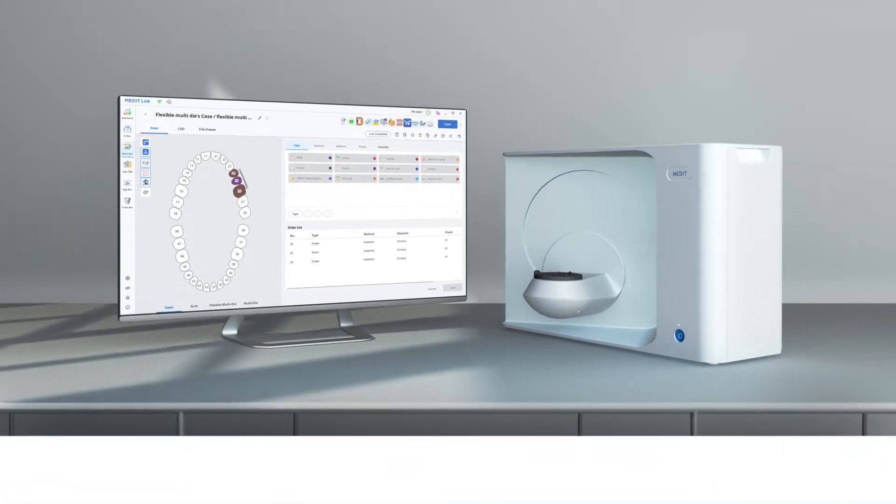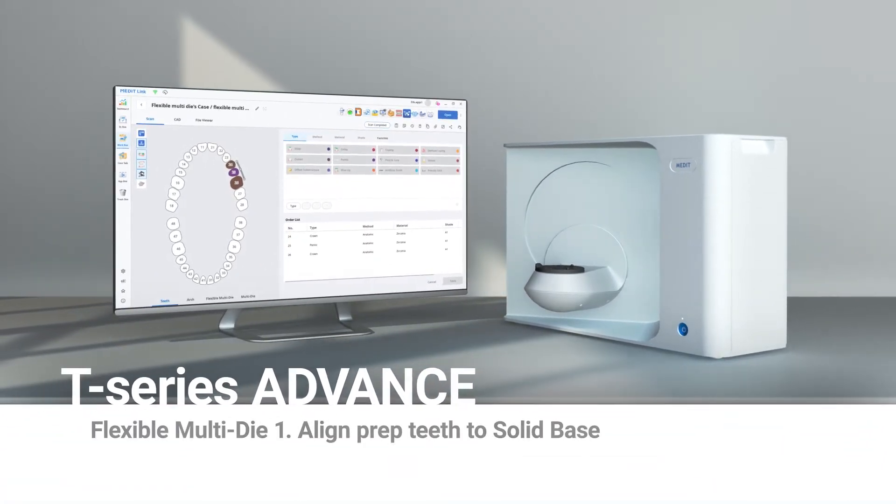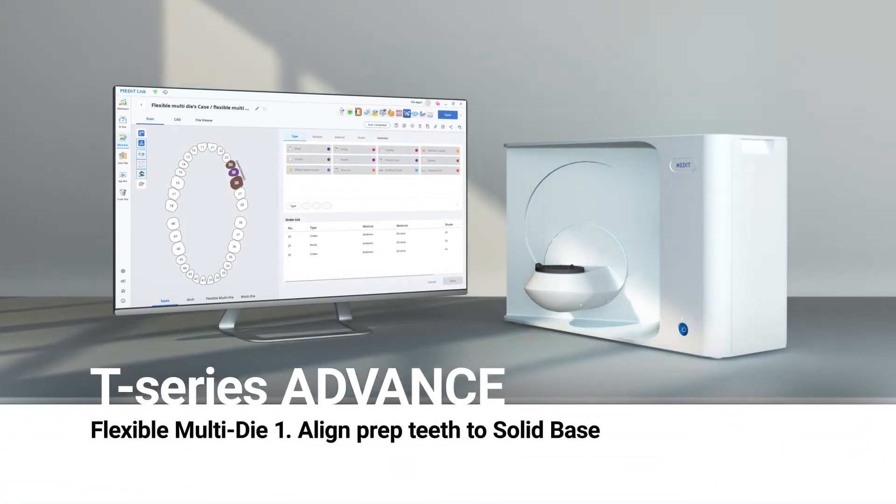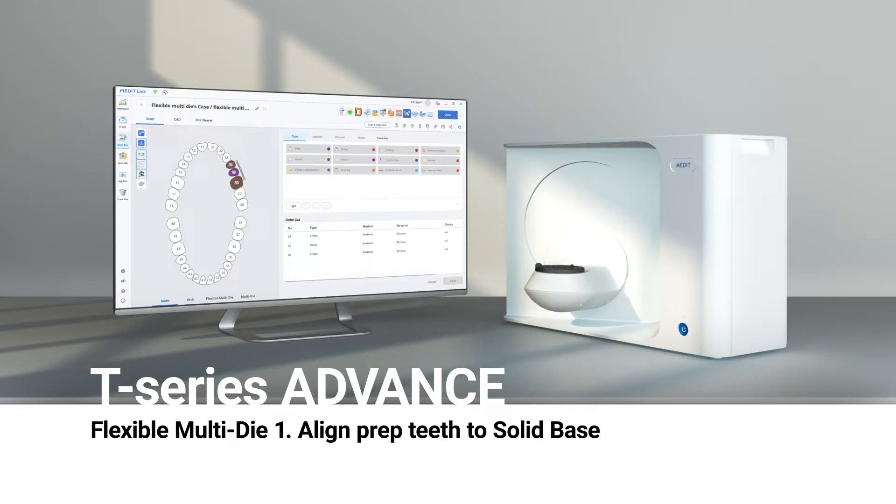This is a quick guide on how to scan with flexible multi-die and align prep teeth to solid base. This mode is suitable for the quad size model to quickly scan and assign data.